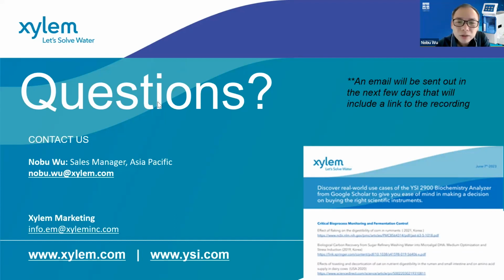You mentioned 2500 or 2900 is 21 CFR Part 11 compliant. Is this only for user management or data integrity as well? I think only the 2900 or 2950 is 21 CFR Part 11 compliant. That means there is a particular page where you can turn this 21 CFR Part 11 compliance on as enabled. Then you will be able to give administrator rights, calibrator, or set different levels of access, or even let the instrument be used as operator only. That means they cannot change everything inside it.